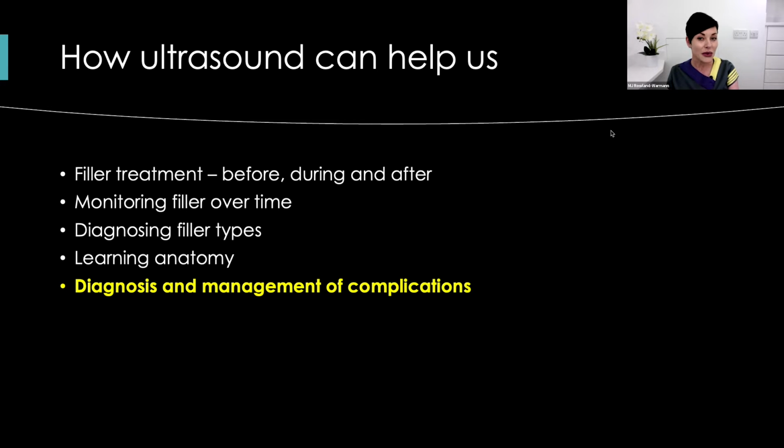But one major use is in dermal filler complications. Diagnosing and managing complications has arguably taken a giant leap forward since ultrasound. Being able to see beneath the surface of the skin to identify problems from filler is revolutionary. Gone are the days when we're left guessing what the problem is or even where the problem is. Now, this simple 2-minute diagnostic can help us resolve problems swiftly and effectively.